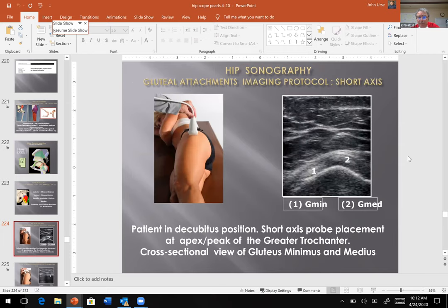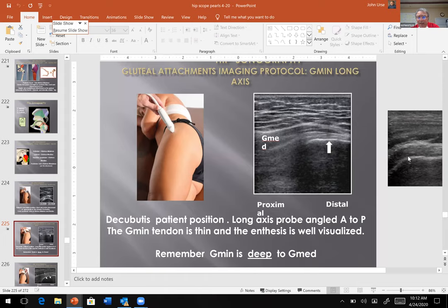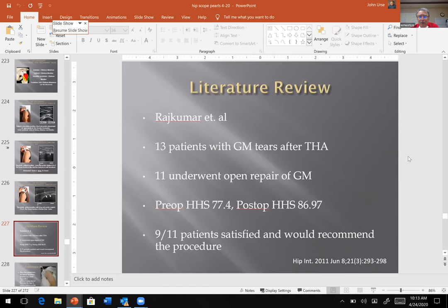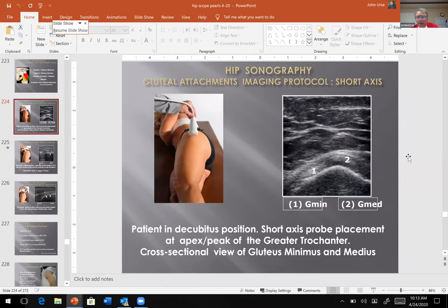You can use your ultrasound to see the glute tendons. The minimus is one. So just start looking at steep and shallow roof lines, and you'll be able to figure out that a medius tendon is more horizontal. You can see both sides of it. This almost looks like a shoulder if you do ultrasounds on shoulders, and it looks like a supraspinatus tendon. You can see a bottom and top of the tendon. Just to go over that again, this more steep angle, number one, is the minimus. Horizontal is the medius.